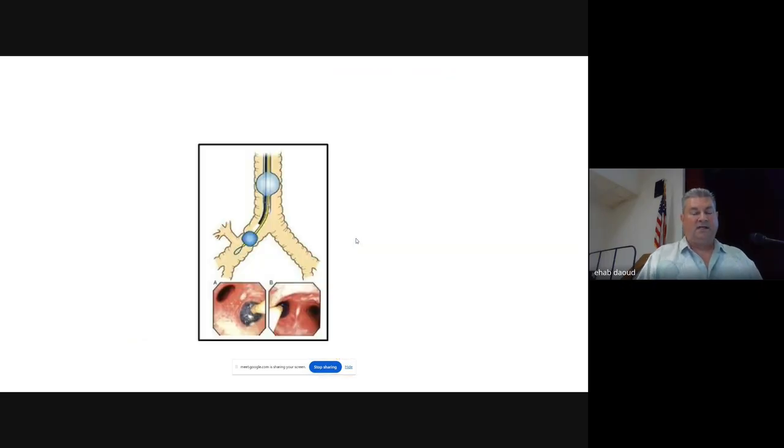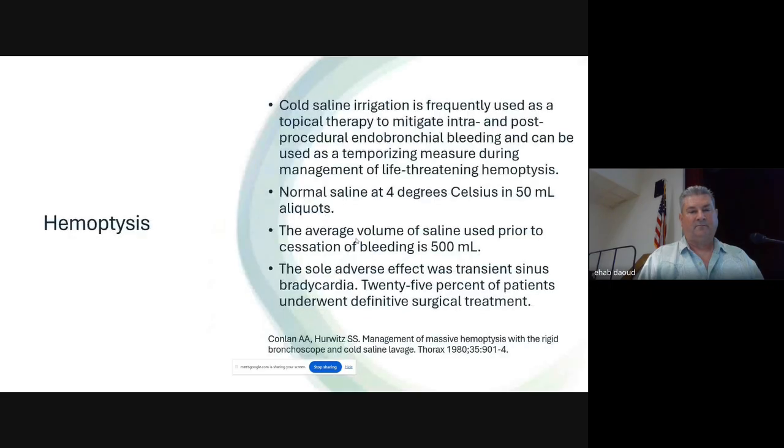And then occlude the site that's bleeding until you get control of hemostasis or correct their coags or whatever the issue is. A couple of days of antibiotics and steroids, and come back and take it out and clean up. Hopefully your patient can tolerate that, because a lot of them, like I said, don't have a lot of reserve to tolerate losing a lobe even.